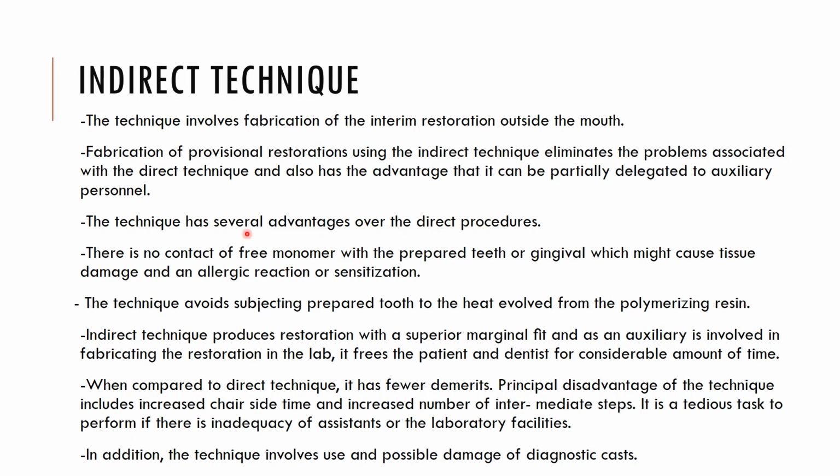Indirect technique: this technique involves fabrication of the interim restoration outside the mouth, eliminating the problems associated with the direct technique. It also has the advantage that it can be partially delegated to auxiliary personnel.